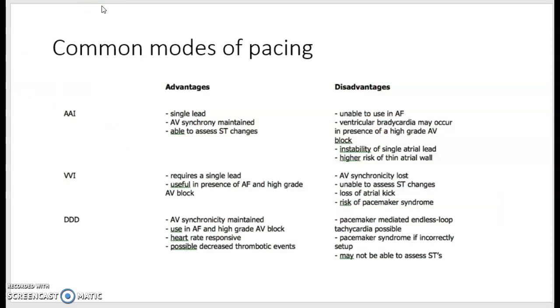These are the common modes of pacing. So you're going to see a big list of advantages and disadvantages. I will not go over all of them in class today. However, you will have this slide up while you are doing one of your activities. It won't be a bad idea to look at it. I would read through all of these. But we're going to talk about AAI, VVI, and DDD.